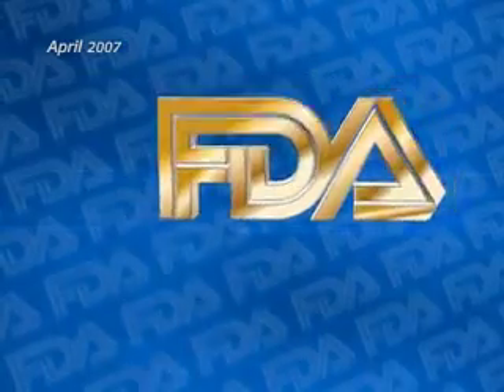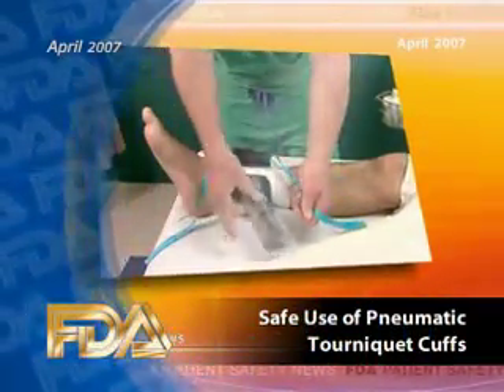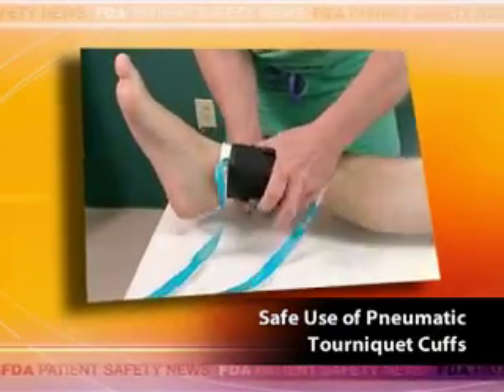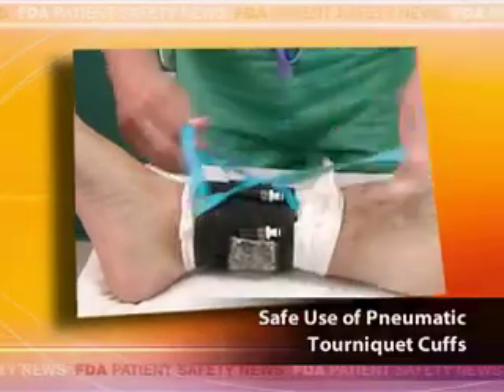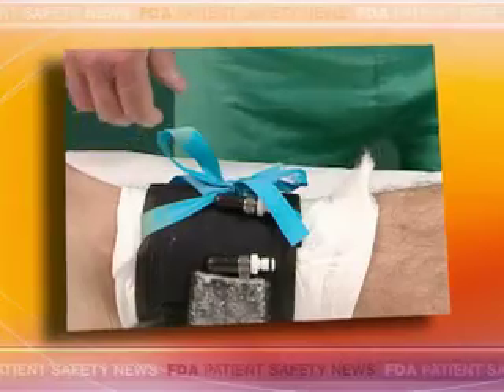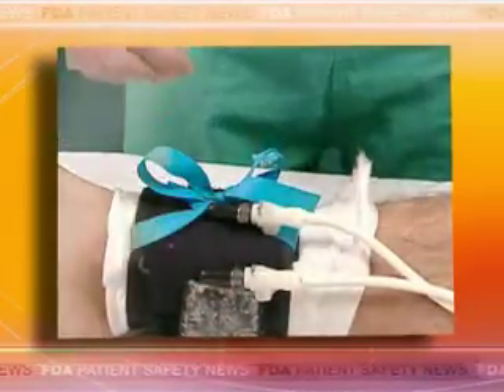This story from April 2007 described how to be sure that pneumatic tourniquet cuffs are working properly and keeping your operative field bloodless. Pneumatic tourniquet systems are used to compress the patient's blood vessels during a surgical procedure, which helps to ensure a bloodless operative field. But their effectiveness can be compromised if the tourniquet cuffs become crinkled, folded, or bent, causing insufficient or inconsistent pressure and resulting in poor control of blood flow to the affected area.